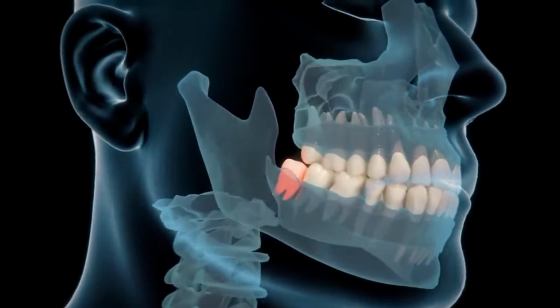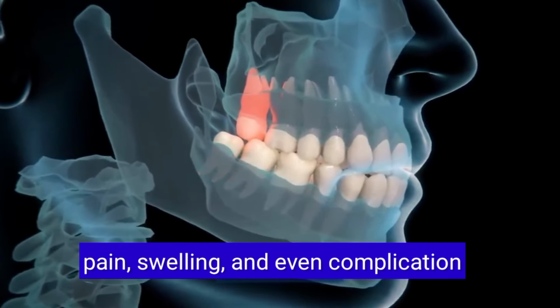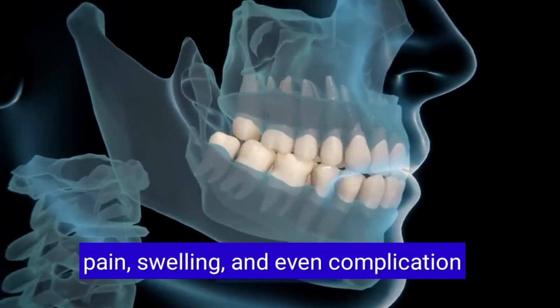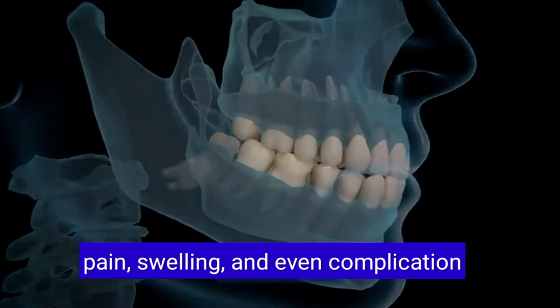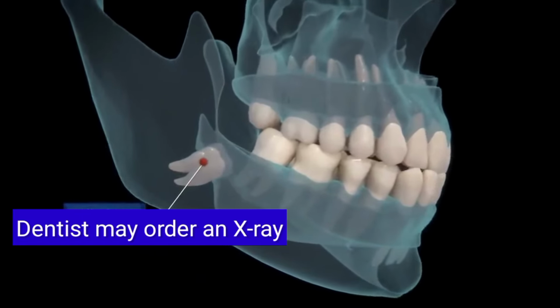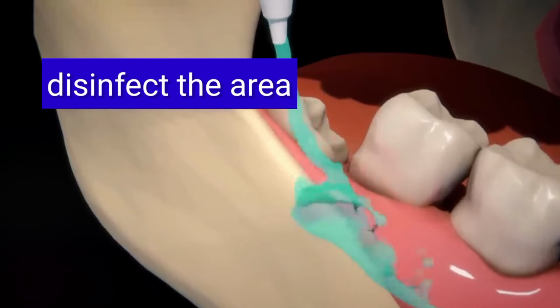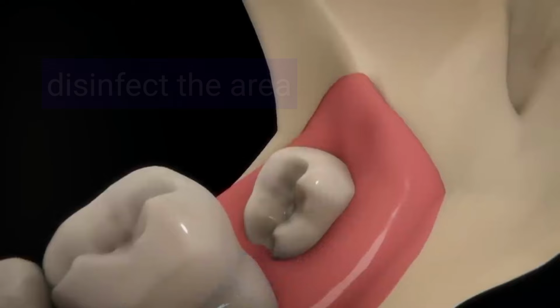In some cases, there simply isn't enough room for wisdom teeth to grow normally. When this happens, they can push against other teeth, causing severe pain, swelling, and even complications like infections or crowded teeth. If your wisdom teeth are causing problems, your dentist may order an X-ray to evaluate the teeth and surrounding nerves before proceeding. Once it's clear the teeth need removal, the dentist will disinfect the area and determine the best type of anesthesia for the procedure.